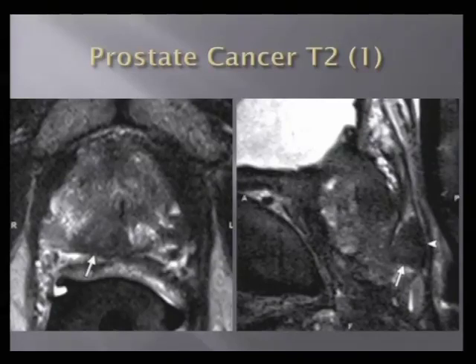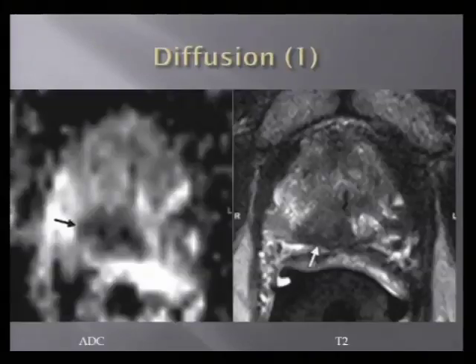That's really important. It's one of the three facets of multiparametric imaging, which all articles will talk about. One is T2 weighting, and you see decreased T2 signal. So this is an example of prostate cancer here. Left is axial, and on the right is a sagittal image.